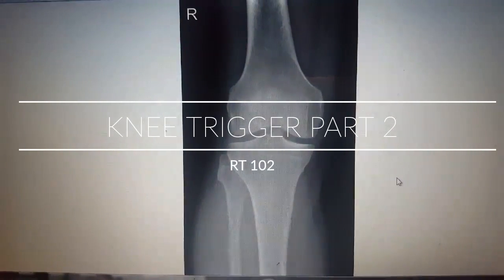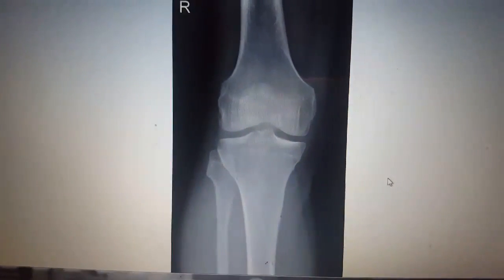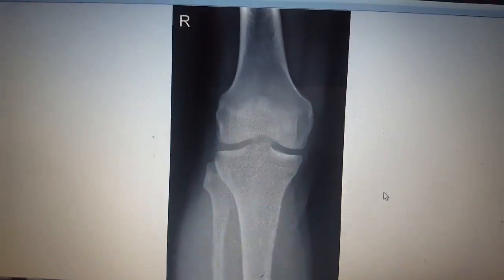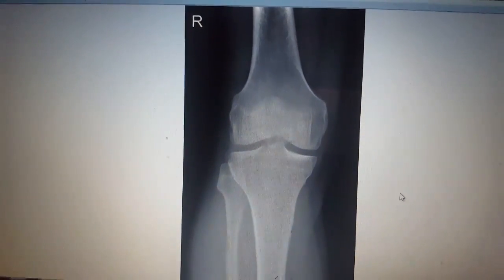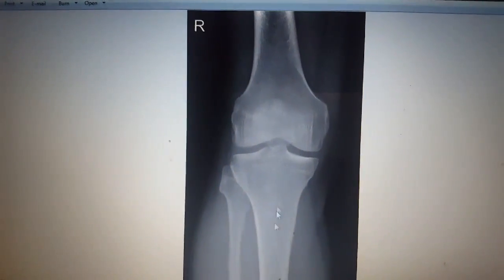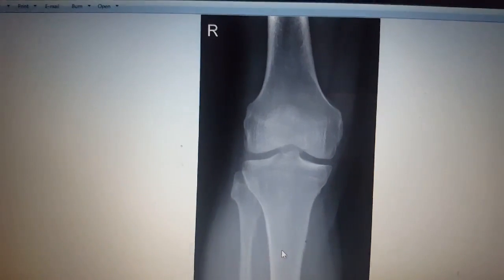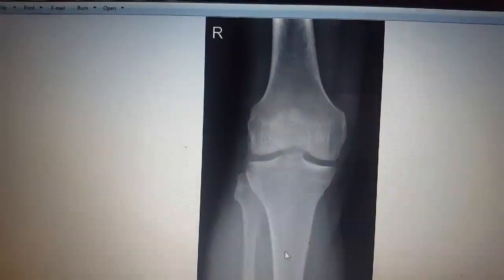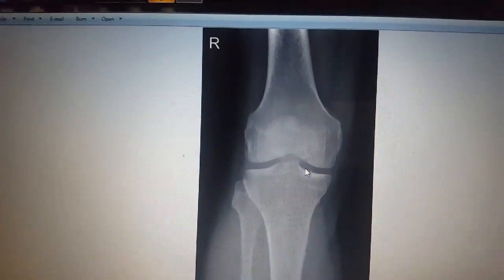The evaluation criteria for the AP knee projection consist of evidence of proper collimation, also the knee fully extended if the patient's condition permits. So making sure that our knee is fully extended from top to bottom, from the femur down to the tib-fib. Also the entire knee without rotation. So here you can see we have our knee.